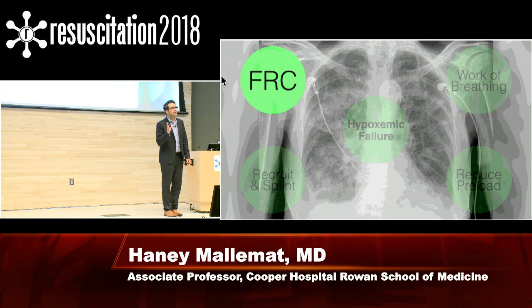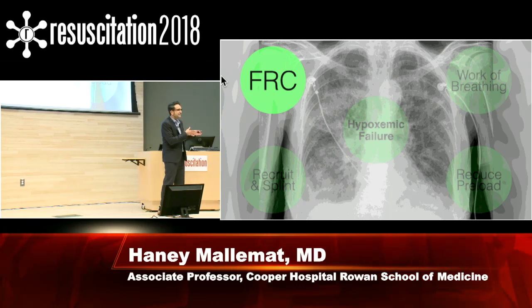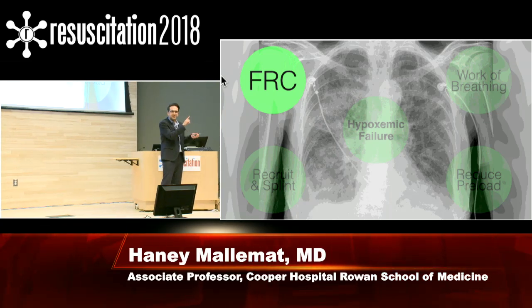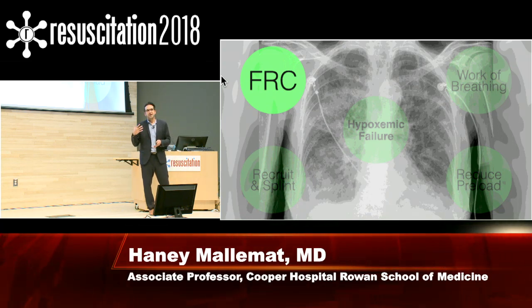And a really simple way of thinking about FRC is it's just that little part of your gas tank that holds that gasoline when that light comes on and says, you know, you got a couple more miles. That's what FRC is. It gives you your apnea time. It gives you your reserve. So CPAP helps with patients who have type 1 respiratory failure. It helps them with that FRC.